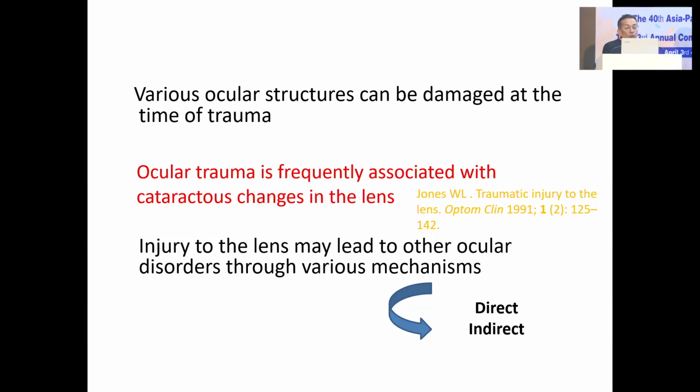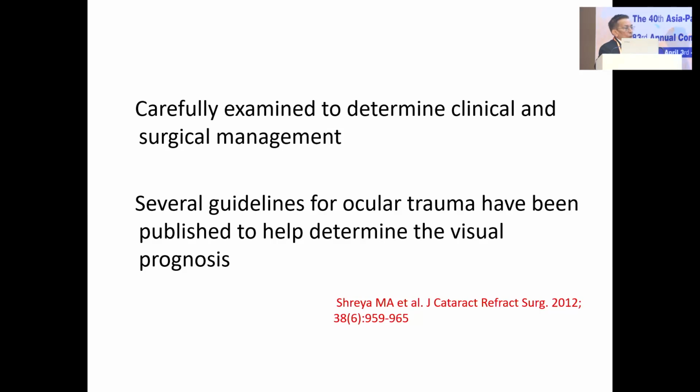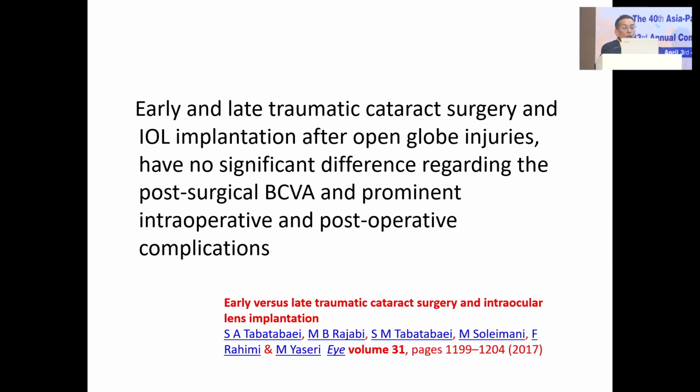I am going to cover just one or two presentations in this session, with videos and techniques for managing post-traumatic cataract surgery and aphakia. Early and late traumatic cataract surgery and IOL implantation after open globe injuries have no significant difference regarding post-surgical best corrected visual acuity. So you can plan either simultaneously or later on.